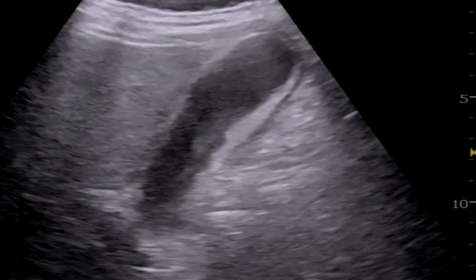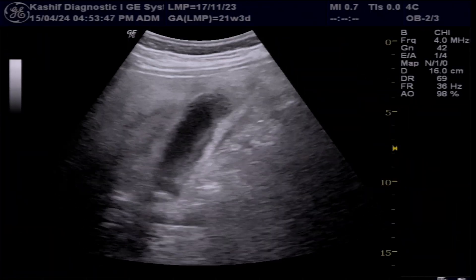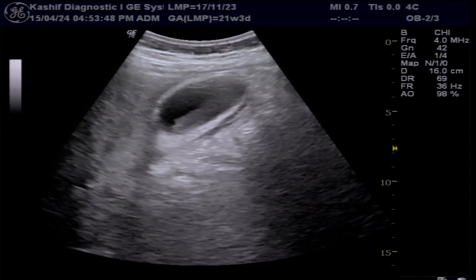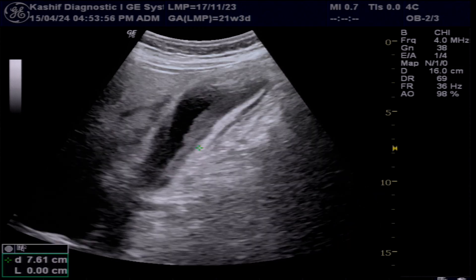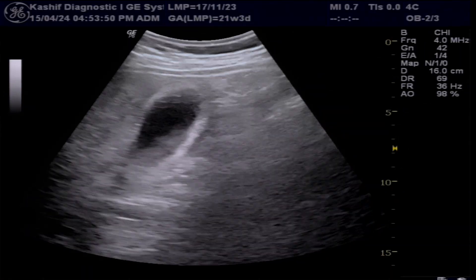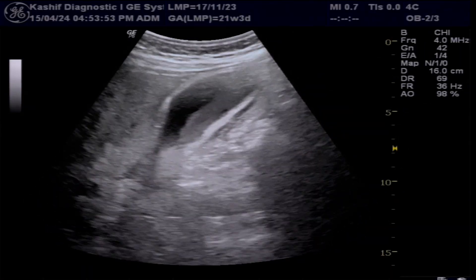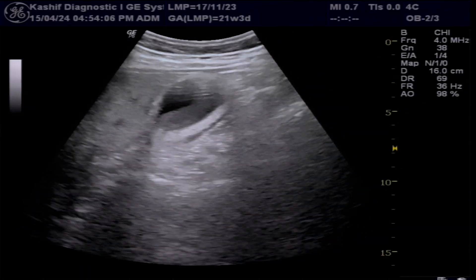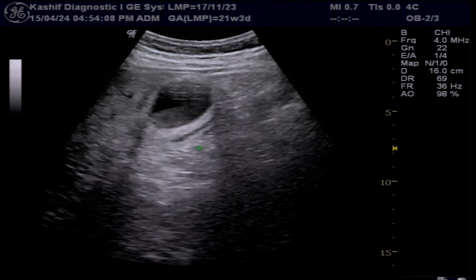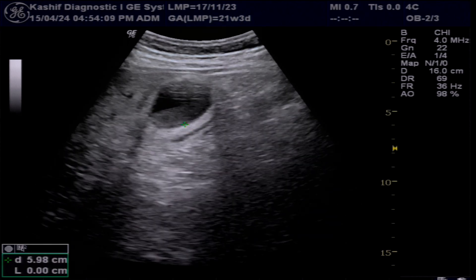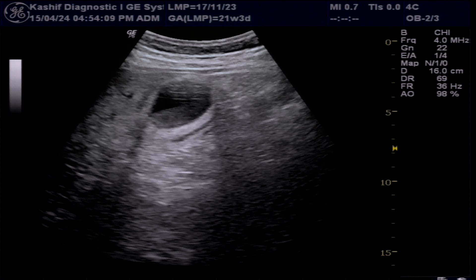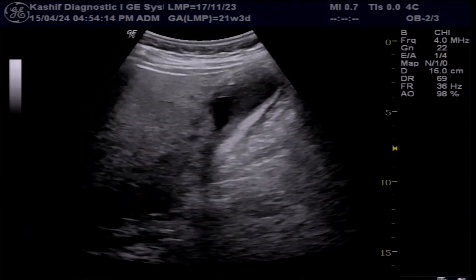The gallbladder is grossly distended, measuring 11.5 centimeters — normal is less than 9 centimeters. The wall is thick at 5.3 millimeters, whereas normal wall thickness is less than 3 millimeters.